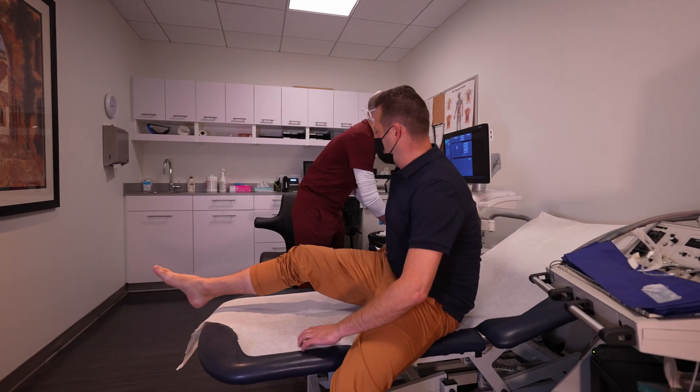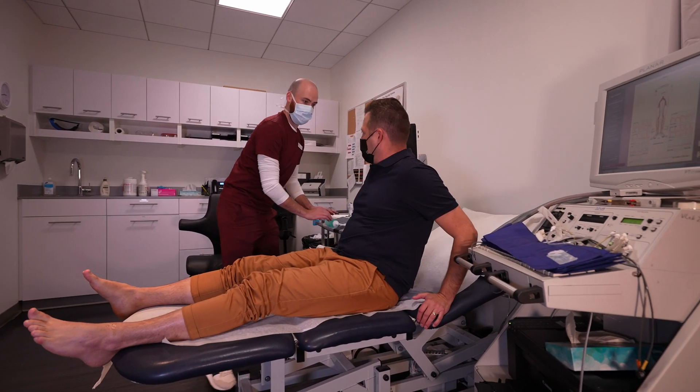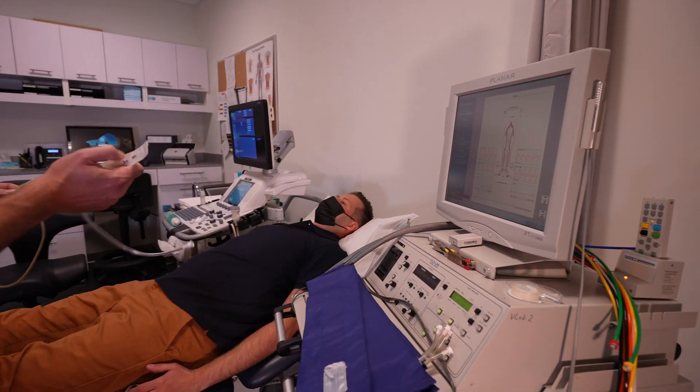There's a separate changing cubicle in each room for the patient. Depending on what test is being performed, you may be asked to change into a pair of shorts or a t-shirt, or simply lift up your shirt so we can access your abdomen.